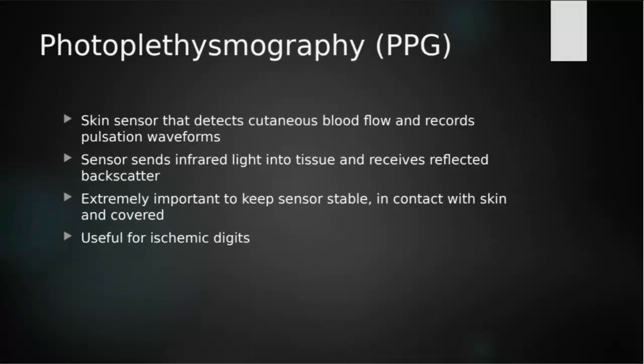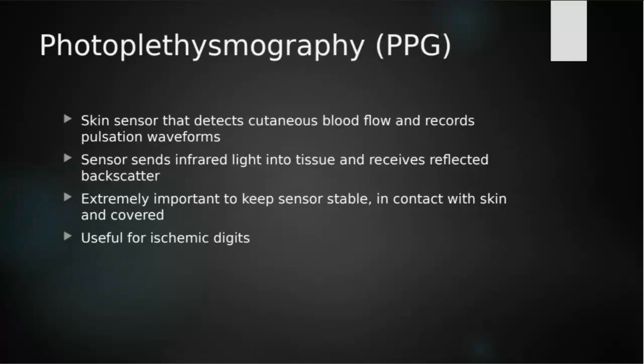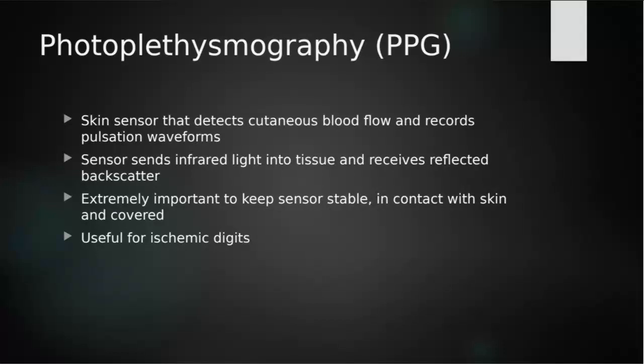So if we have blue toe syndrome, we have necrotic toes, we have very bad diabetes, we need to make sure we know how to use a PPG sensor. We have to tape these to patients' toes. We have to keep them stable, and we have to keep them covered. So you have to put a towel over them, because the infrared light can go out and scatter and pick up a lot of different things in the surrounding room. So you want to make sure that you put a towel over it so that it's nice and dark.